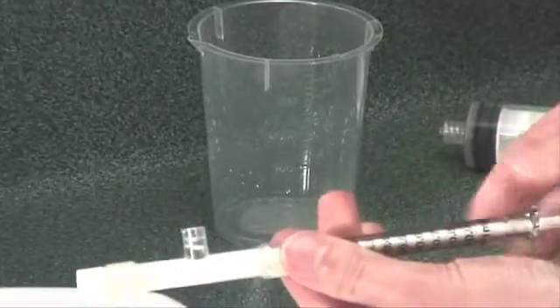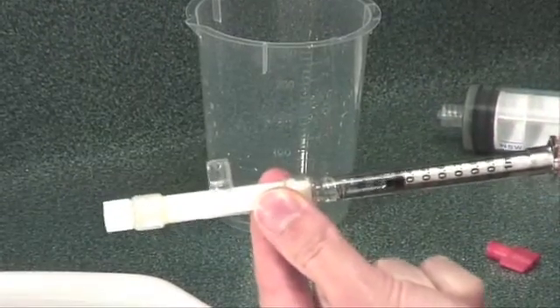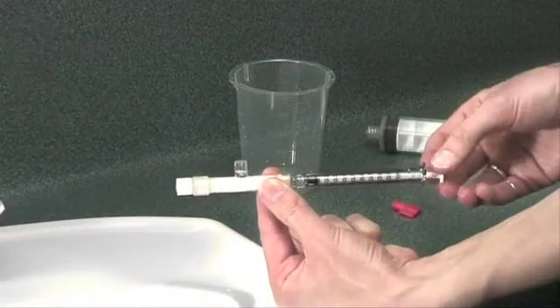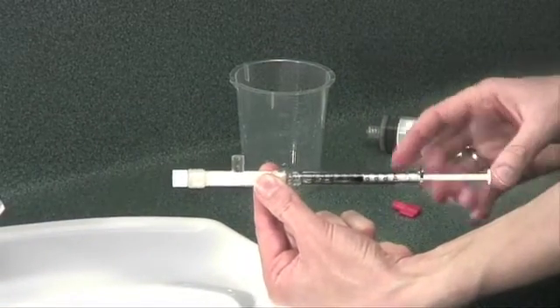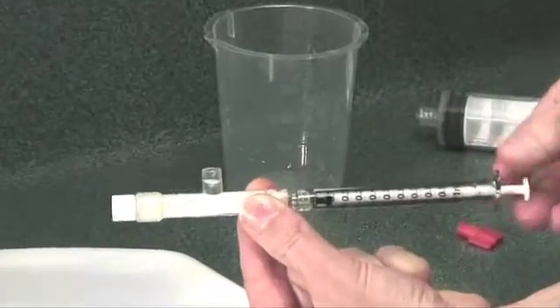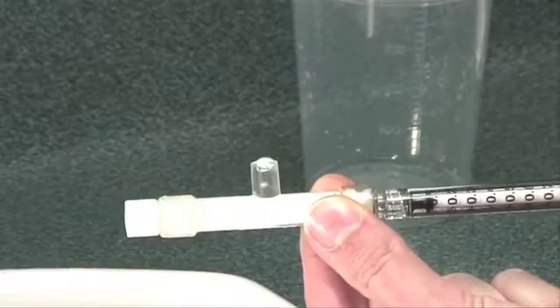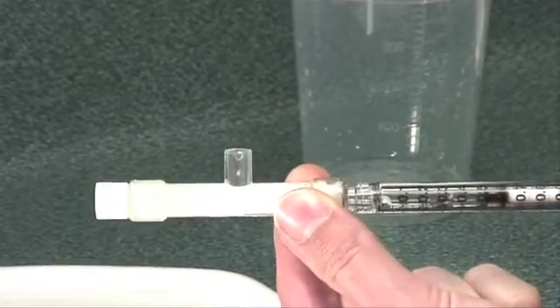While attached to the filter, pull the syringe back to the 0.5ml mark. Now re-inject the content of the syringe back into the filter. Repeat this process three times until the sample content is back in the filter.